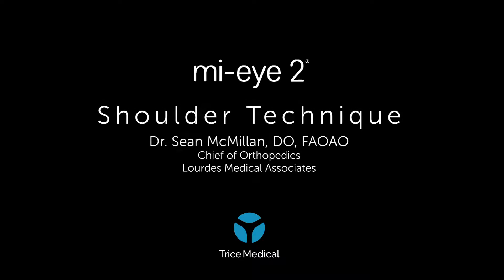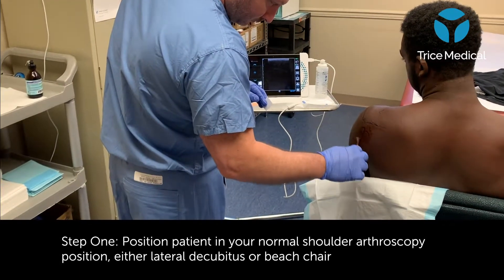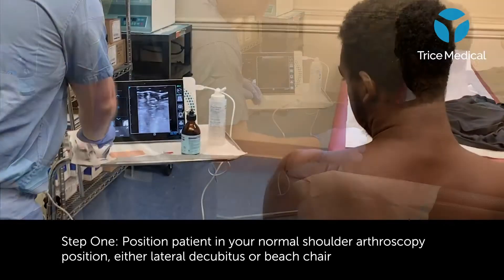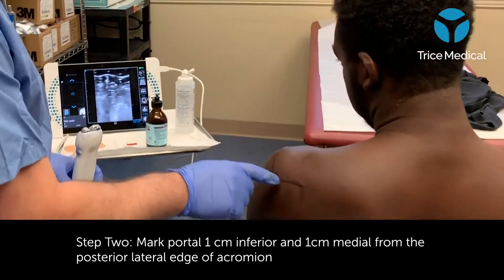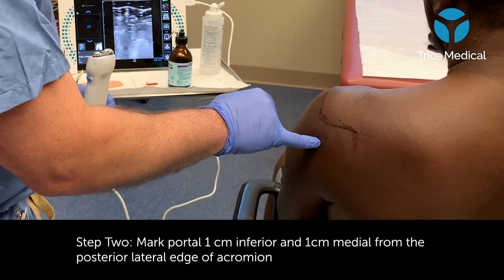The following is a technique for in-office needle arthroscopy of the shoulder. Initially, I'll position the patient sitting up in a beach chair position. I'll prep the back of the shoulder using the landmarks of 1 cm inferior and 1 cm medial to the posterior lateral edge of the acromion.